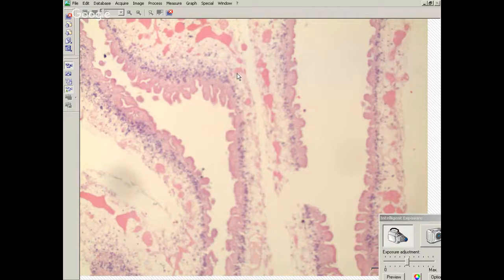You get the tapeworm. Right. So this is from either environmental contaminant of the eggs from the tapeworm. So the proglottids are the segments of the tapeworm that break off. So you got a cat or a dog, they get cat and dog tapeworms, and you get this little moving proglottid, this ugly looking segment of tapeworm.